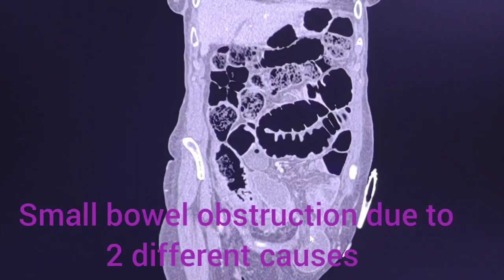Hello dear friends, this is a case of an acute abdomen.